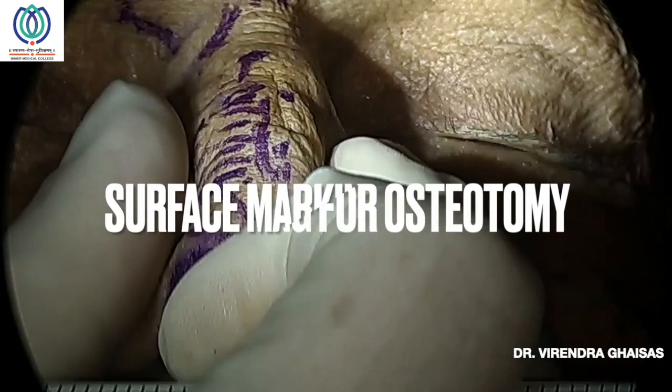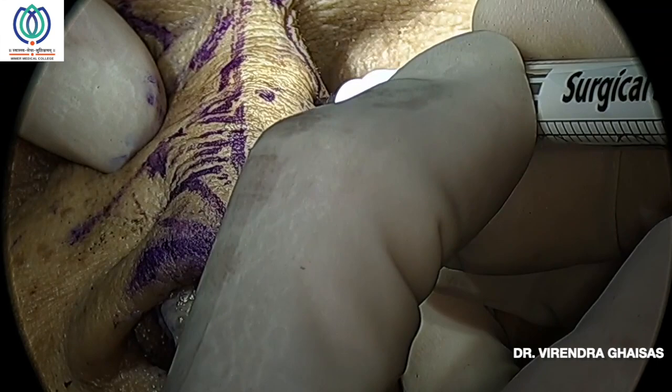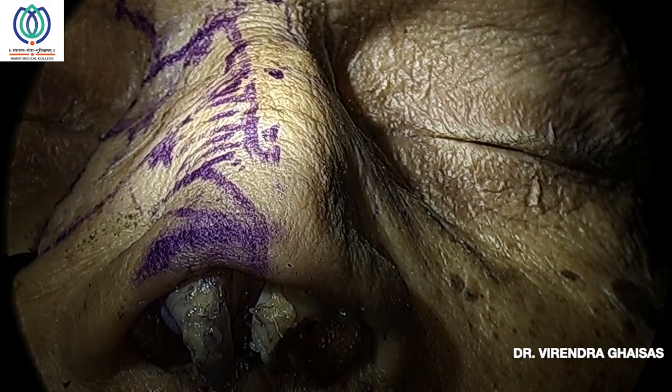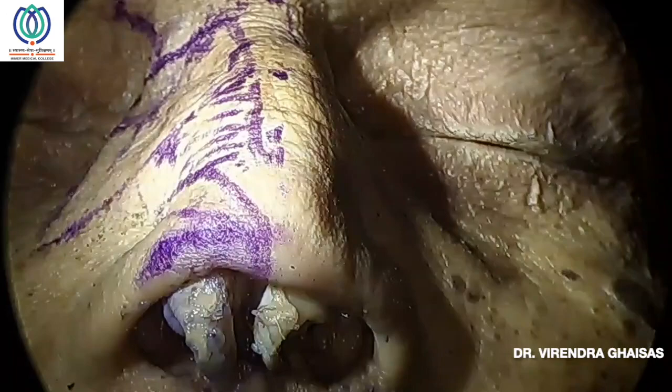Osteotomy is a really important step in rhinoplasty. There are intermediate osteotomies, paramedian osteotomies, transverse osteotomies, and lateral osteotomies. Intermediate osteotomy is the least done osteotomy. So we'll focus mainly on the paramedian osteotomy, which is done just lateral to the septum. Then the lateral osteotomy, which is in the nasofacial groove, from the medial canthus till the piriform aperture.